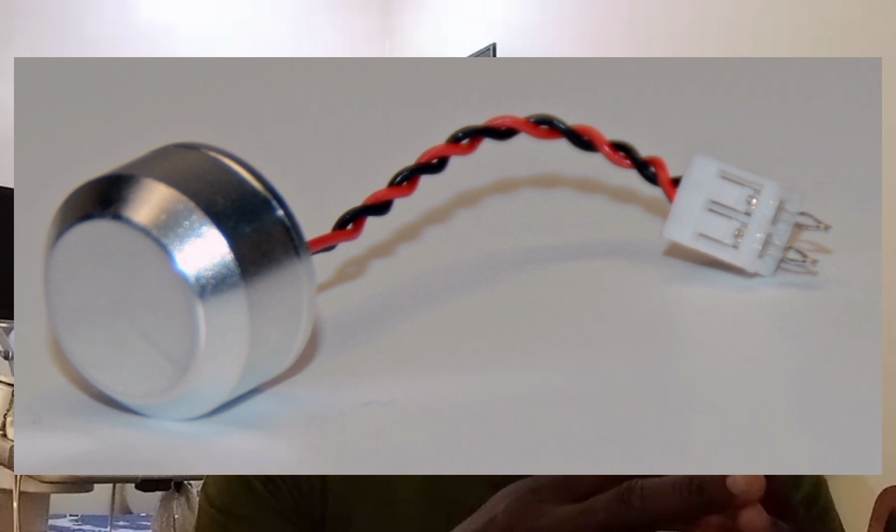Piezoelectric crystal, let's look at the active elements. The piezoelectric crystal or active element is located at the face of the transducer. It is a flat circular disc with an approximate diameter of 6 to 19 millimeter and a thickness of 0.2 to 2 millimeter. This crystal can generate ultrasound pulses when applied with a voltage. They act as receivers of returning echoes, and they generate electricity or voltage in response to received echo pressure.